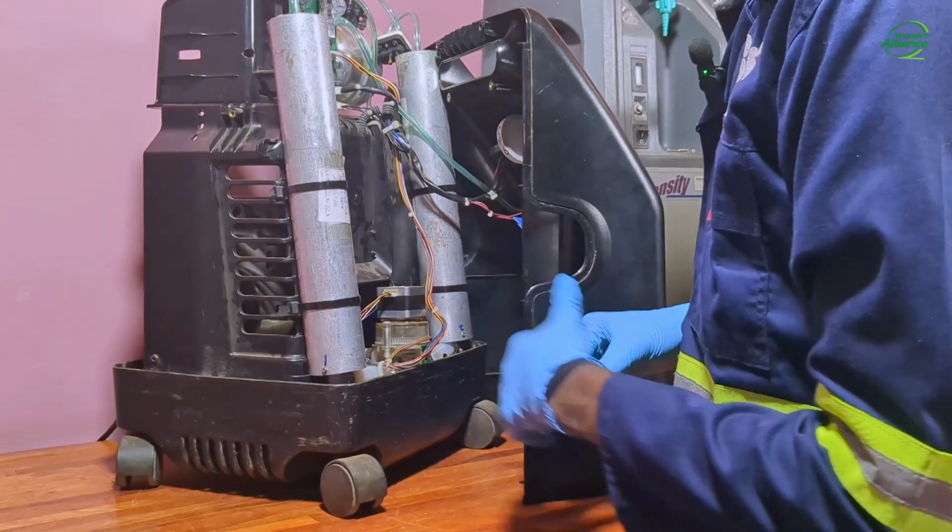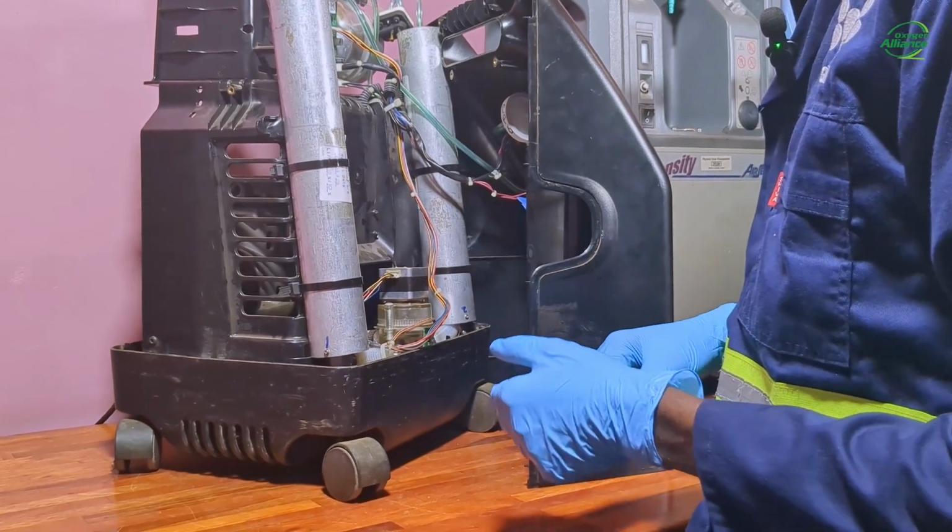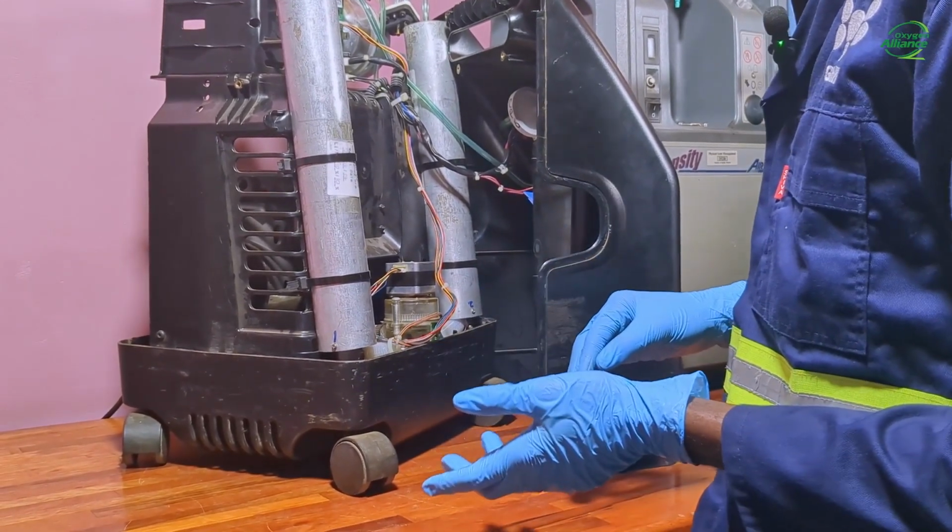As you can see, the valve has stopped rotating. So I'll switch off the concentrator and take you through the different ways to troubleshoot this problem.